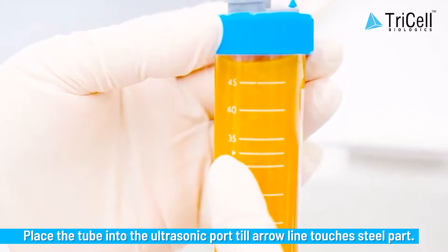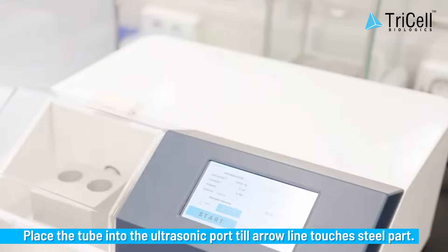Step 4: Place the tube into the ultrasonic port until the arrow line touches the steel part.